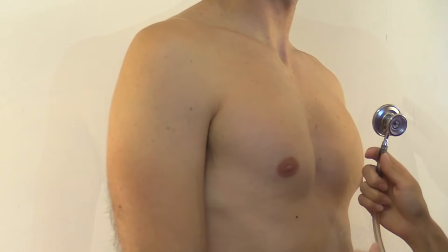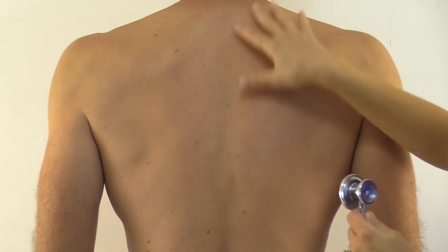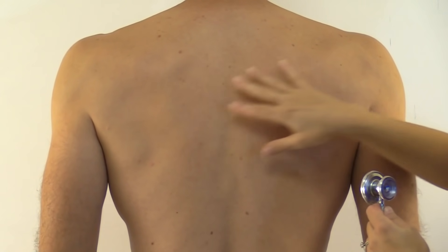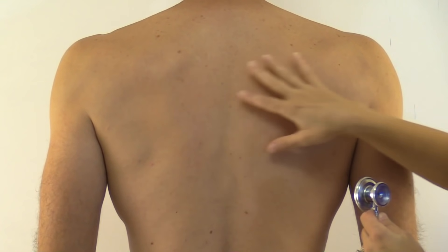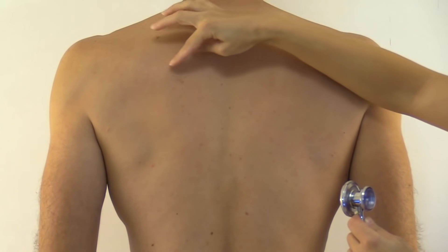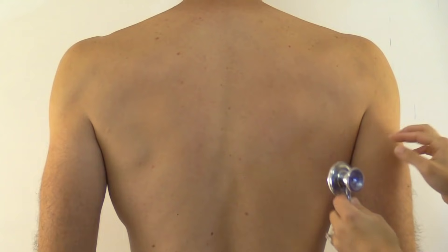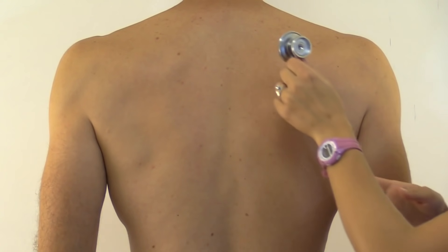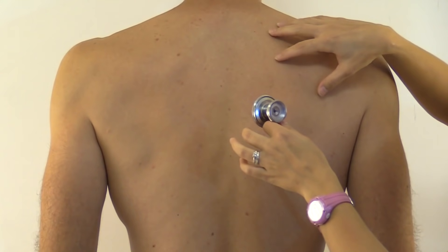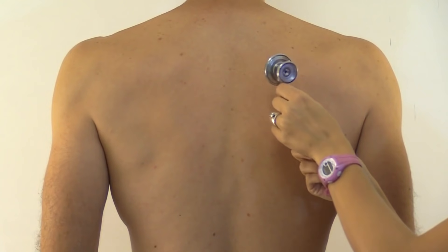Now let's listen posteriorly. Again using the diaphragm, start at the apex and work your way down. One thing to keep in mind: you have the scapula back here, so you don't want to listen over those. Listen in between where the scapula and the spine are — down in those regions. We're going to compare sides, and you can do this part at the end when you turn your patient to look at the backside.